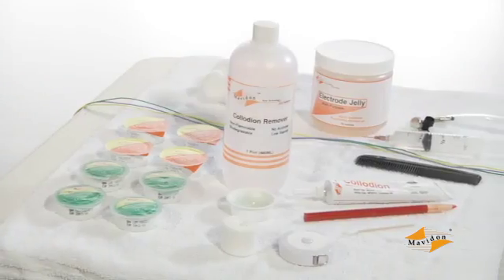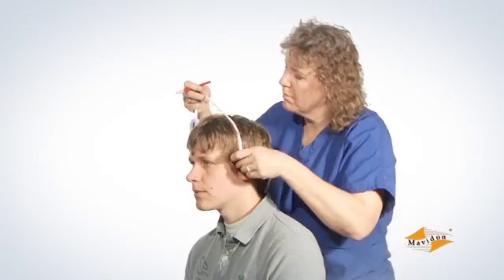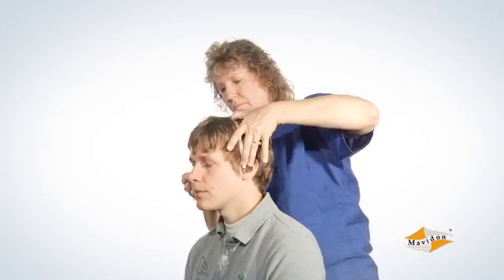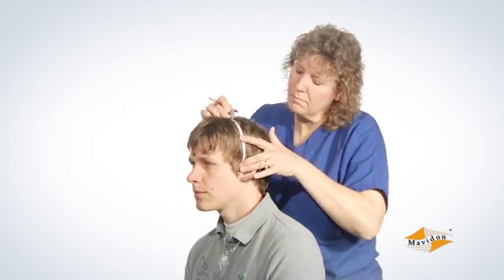Place all of the items together on a tray or countertop within easy reach. Mark the electrode locations on the patient's head with a grease pencil, taking care to be as accurate as possible in your measurements.